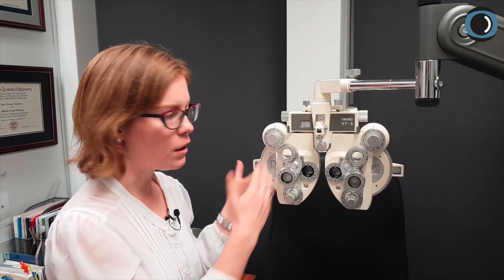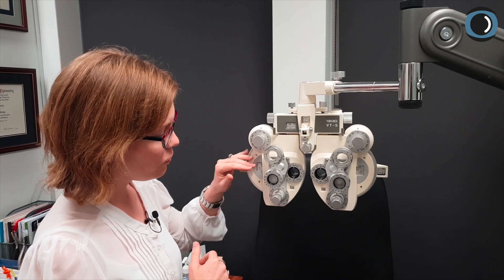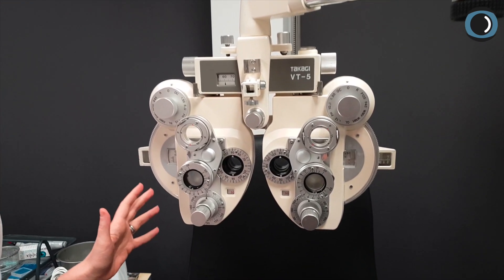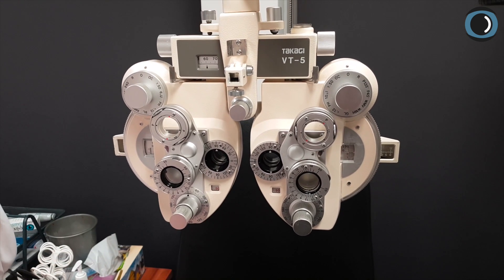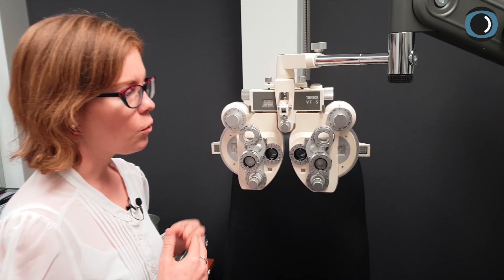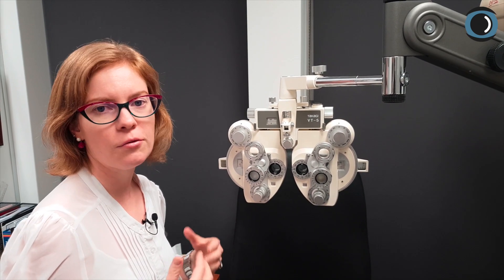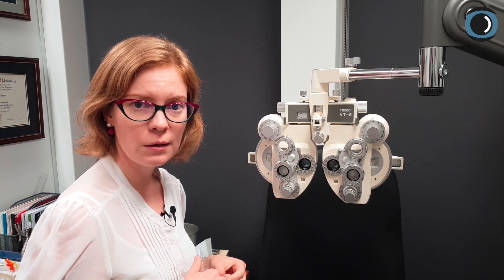Here is our dummy, extremely tall patient. We've tested their refraction: it's plus 1.50 minus 0.50 by 90 in each eye, so it's a very simple refraction. This patient has to have the same acuity in each eye. We're going to presume they have 6/6 or 20/20 vision — or slightly better — in each eye, and we're going to put them on the 6/6 or 20/20 line.